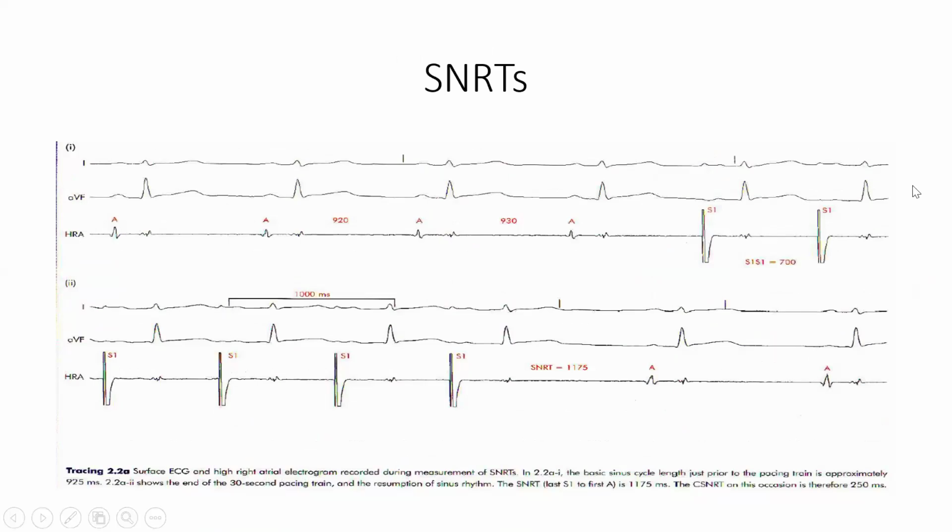We've discussed sinus node recovery time, meaning that after suppressing the SA node and the SA node recovers, the time interval between the last suppression by pacing to the time it recovered is the sinus node recovery time. So for example, we said S1 means you started pacing, right?